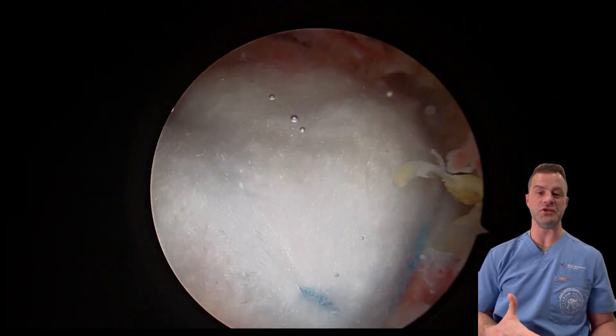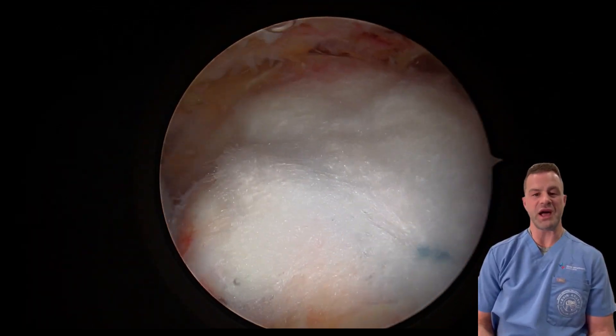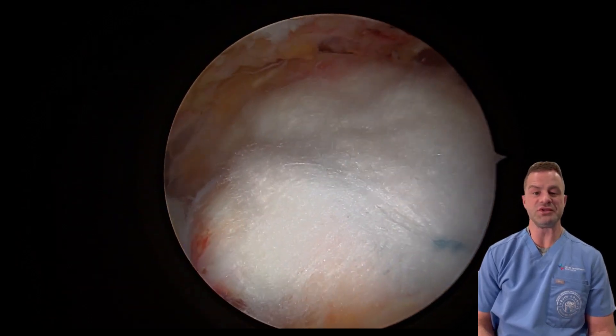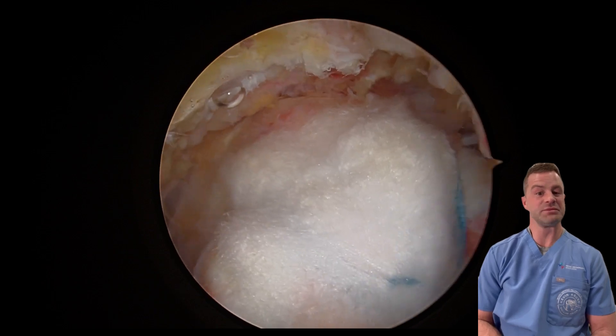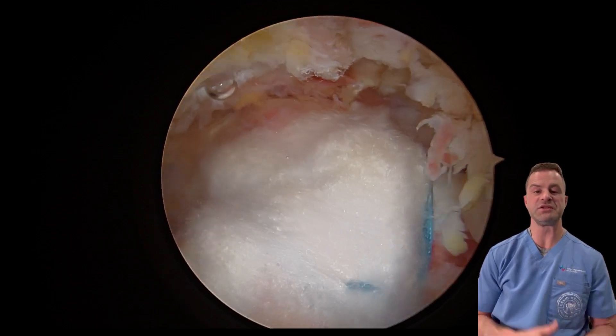The strength is up to 500 newtons, which is close to 100 pounds of pull-out strength, which is incredible. Rotator cuff surgery is incredibly common — in the United States alone, we do 600,000 a year. To be one of only two or three surgeons on earth using this implant right now is pretty exciting and something very unique and beneficial to our patients.